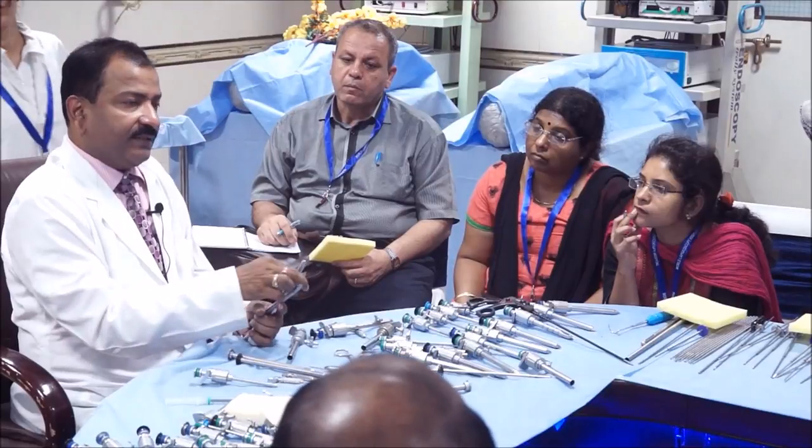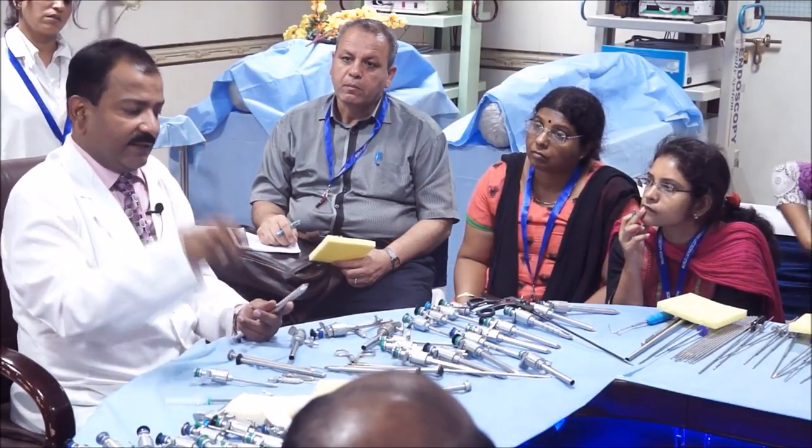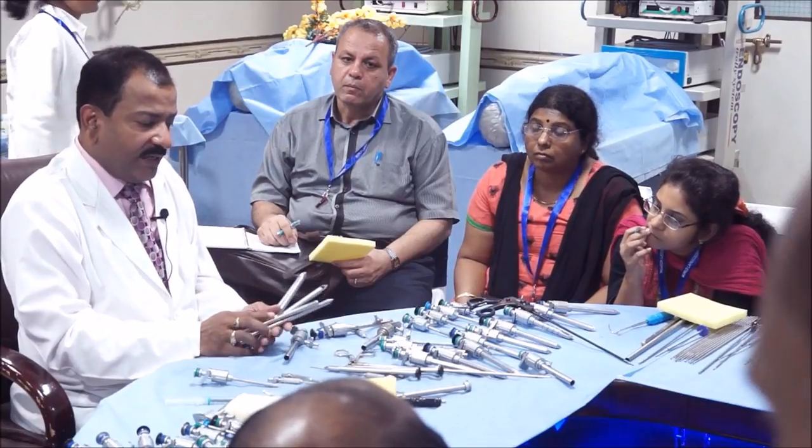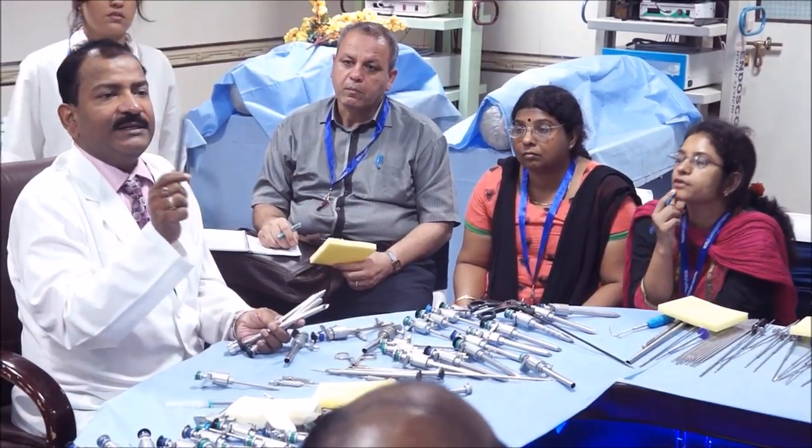Conical trocar, it has only a cone. This is blunt. This is safety. Safety means it has a spring loaded. And these are the different types. But the most popularly used trocar is a pyramidal shaped trocar.